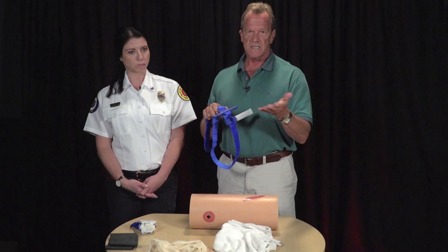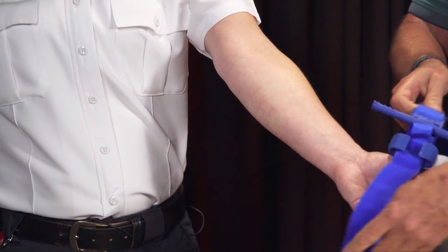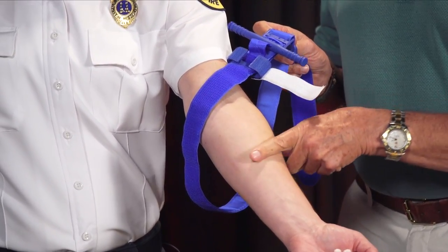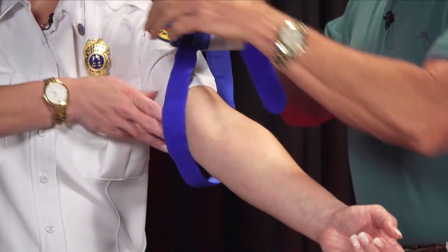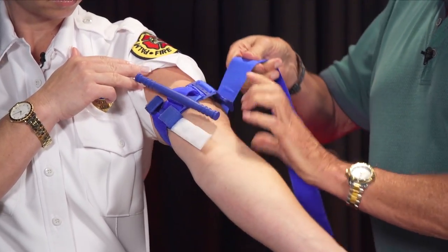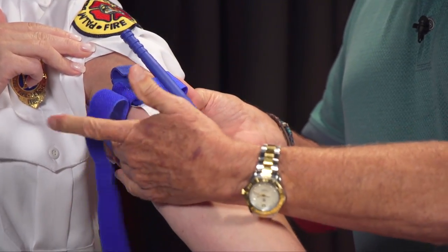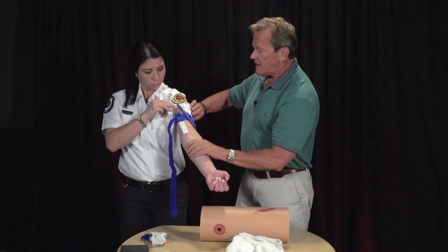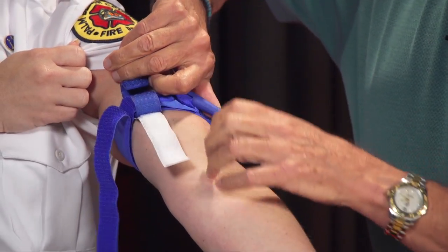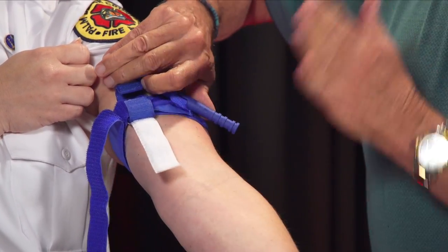Jessica's bleeding here and I haven't been able to stop it with direct pressure, so we're applying a tourniquet. You want to place it at least two to three inches above the injury — or higher on the extremity is acceptable. The key with the CAT tourniquet is when you first put it on, get all the slack out as much as you can and bring that Velcro loop right up to the bottom of the clip. Then use the windlass rod and twist it. If it's tight already, it only takes one or two turns to stop the arterial blood flow.